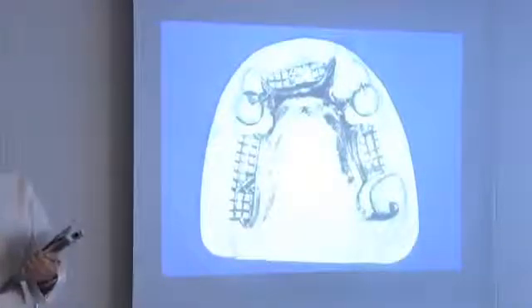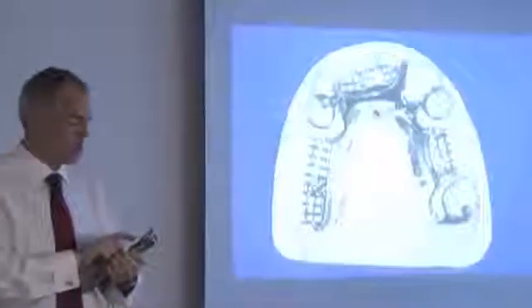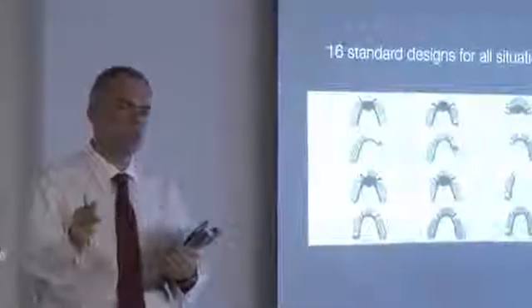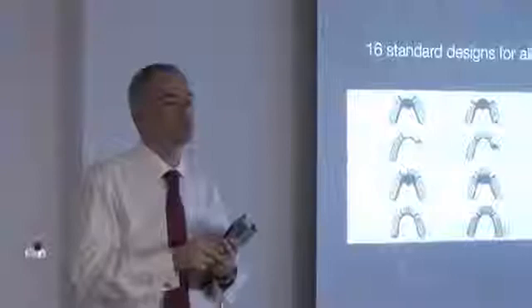How the heck do you design these things? Does it just come out of the ether? Is it on a whim? Reassuringly, there's only 16 designs and they cover every tooth loss possibility. And that comes with the book.